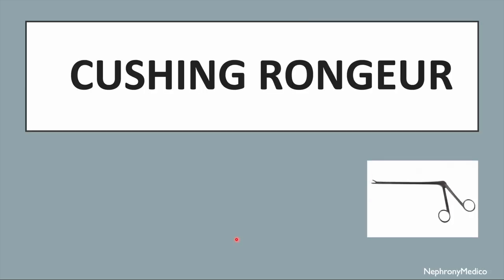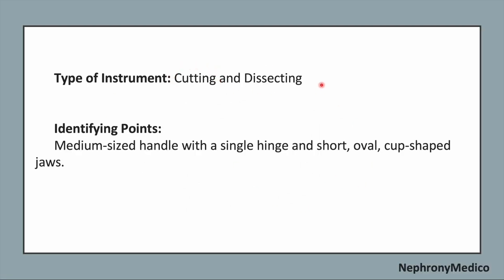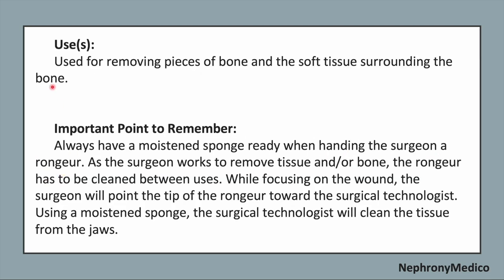Let's talk about Cushing rongeur. This is a picture showing Cushing rongeur. It is a cutting and dissecting type of instrument. Now identifying points: a medium sized handle with a single hinge and short oval cup shaped jaws. Use: it is used for removing pieces of bone and the soft tissue surrounding the bone. Important point to remember while using this instrument: always have a moistened sponge ready when handling the rongeur. As the surgeon works to remove tissue and or bone, the rongeur has to be cleaned between uses. While focusing on the wound, the surgeon will point the tip of the rongeur toward the surgical technologist. Using a moistened sponge, the surgical technologist will clean the tissue from the jaws.